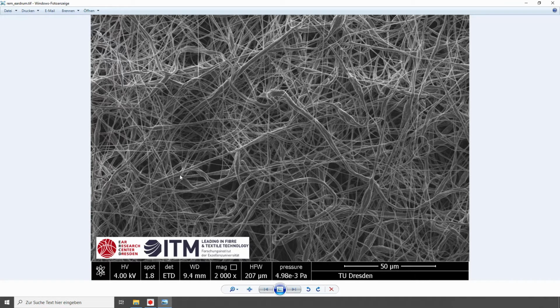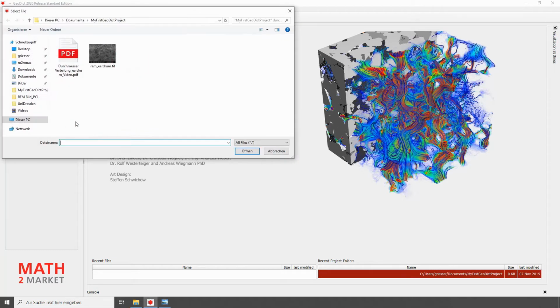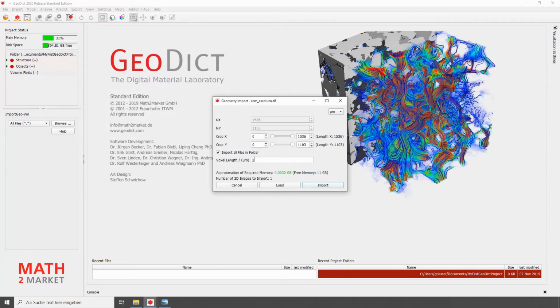To import the SEM image into our software GeoDict, we first need the module Import GeoVol. For this purpose, we click on the button Import in our menu bar and select Import GeoVol. On the side, the view of FiberGeo changes to Import GeoVol. Using the Browse button, we select the image and import it with a voxel length of 1 micrometer. We will define the exact voxel length later.